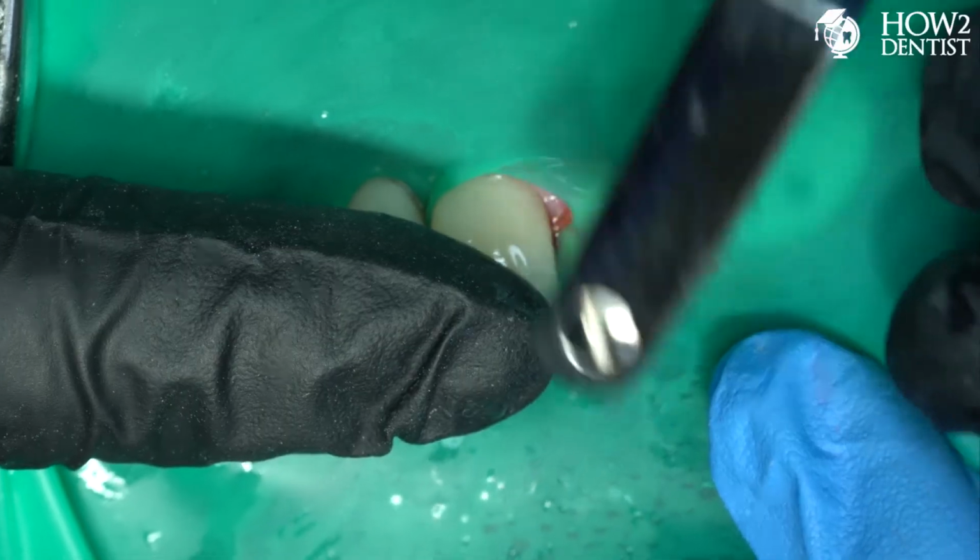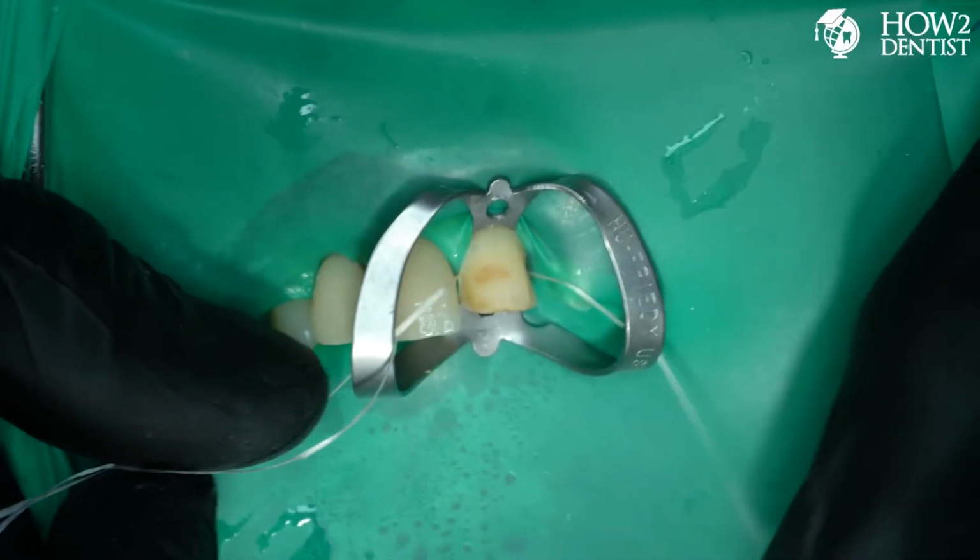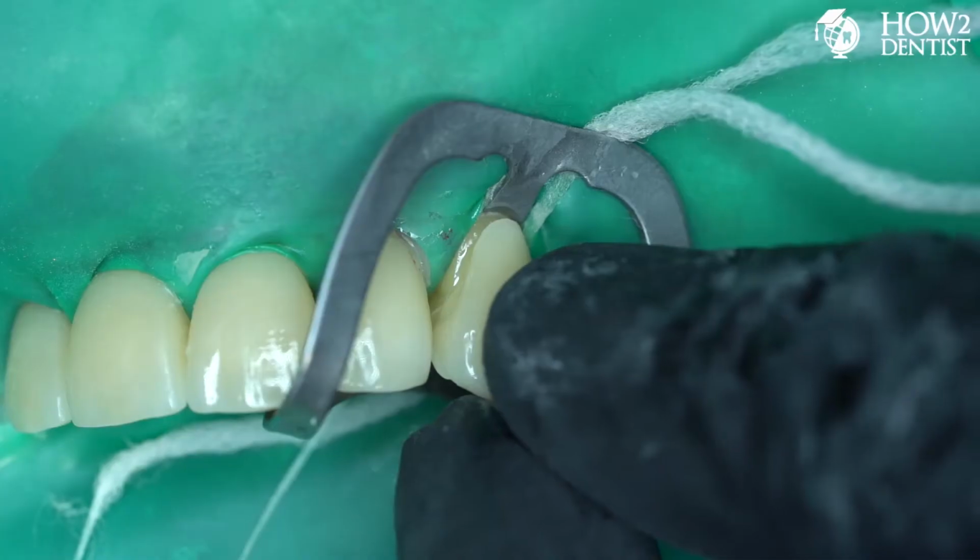In the previous video we shared our vision on the intraoral protocol for fixing ceramic restorations, and today, in an experiment on lithium-silicate ceramics, we will understand the difference between single component and two component silanes.